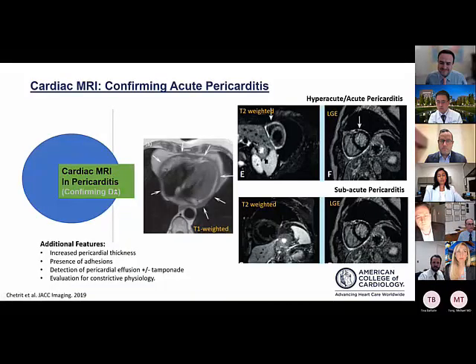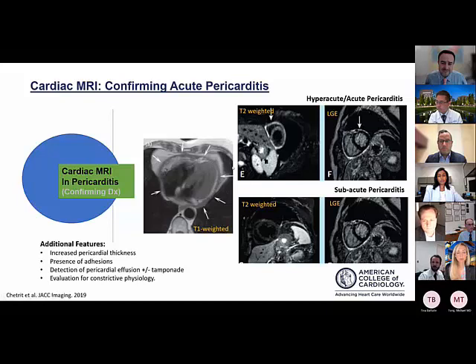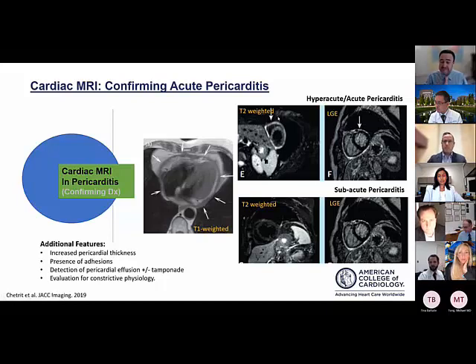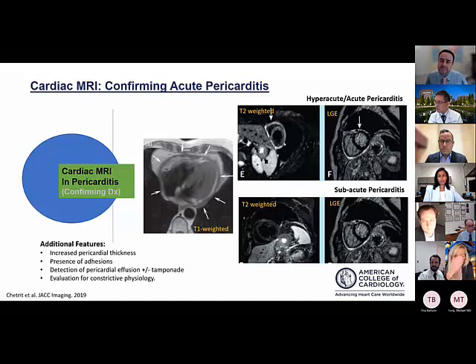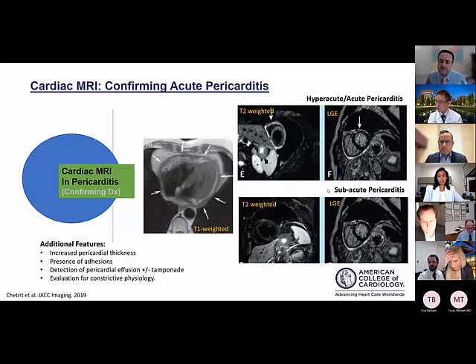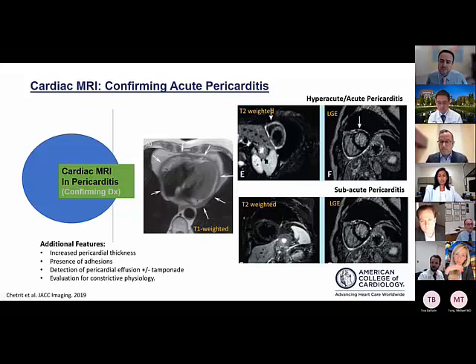On MRI, T1-weighted imaging shows diffuse, thickened pericardium with an inflammatory appearance. In hyperacute or acute pericarditis, T2-weighted imaging shows increased signal indicating edema and inflammation, accompanied by LGE enhancement — reflecting neovascularization. In the subacute phase, T2 signal may not be evident but significant LGE persists, correlating with the presence of neovascularization. Additional features include adhesions and constrictive physiology.